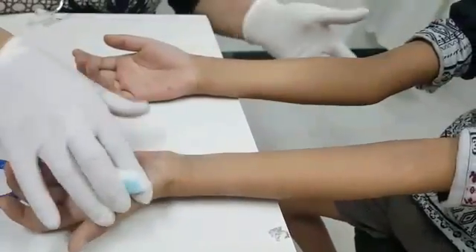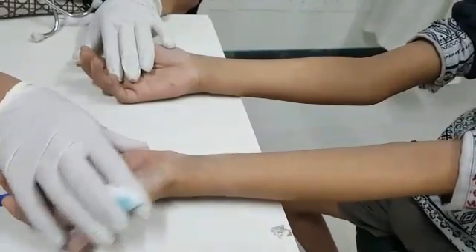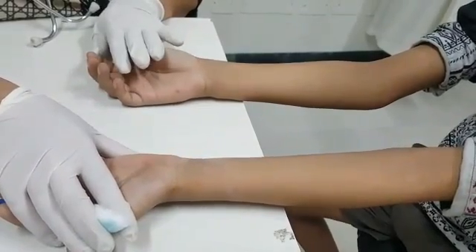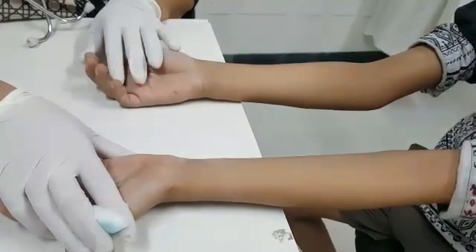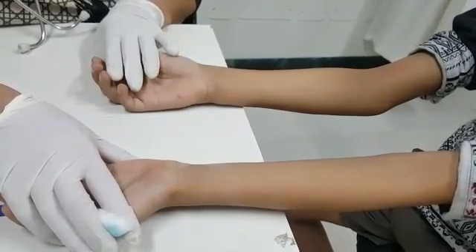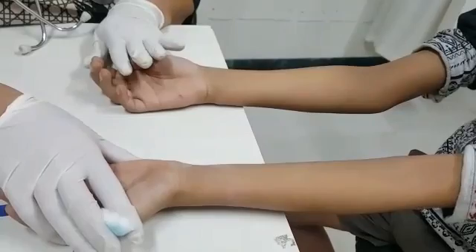We are going to perform a skin prick test for an allergy test on a child. He is around 8 years old. We can do it above 2 years of age, and specifically we get better results above 4 years of age. This child is 8 years old and it is a very simple OPD procedure.